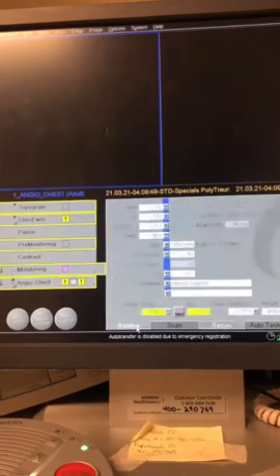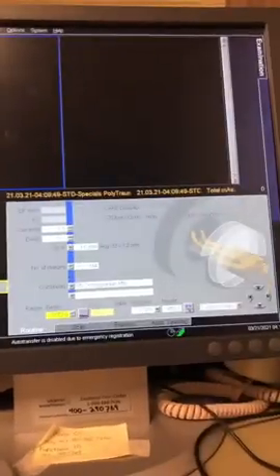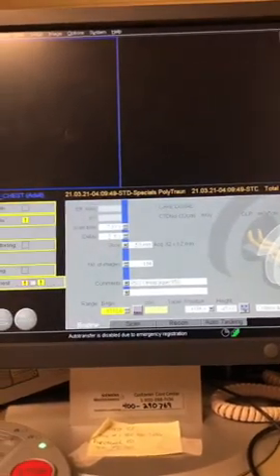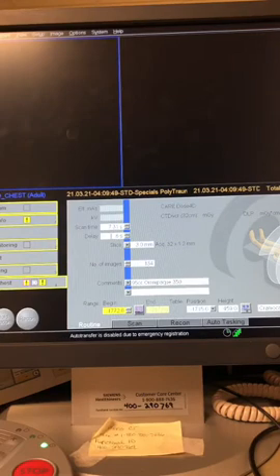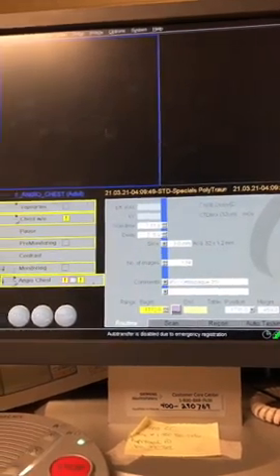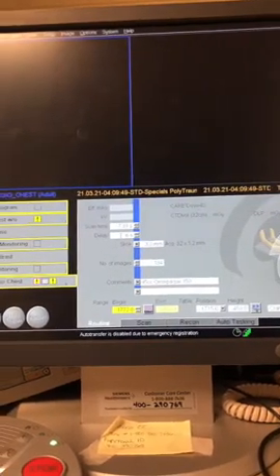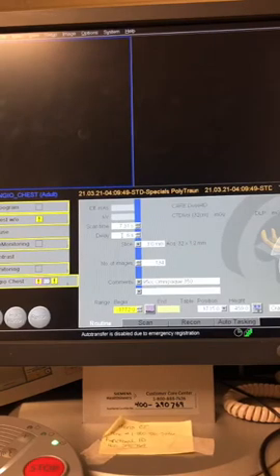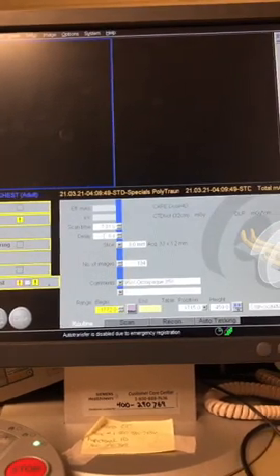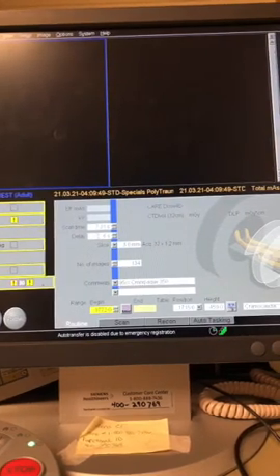The monitoring, it's a 10-second countdown with a 6-second delay. So the angio chest really only varies in protocol from the regular chest width by a 4-second count. So that doesn't seem like a lot, but when you start thinking about like how fast the PE has to go and all these things, like a few seconds makes a huge difference, especially when we're talking about trying to capture contrast-filled arteries.